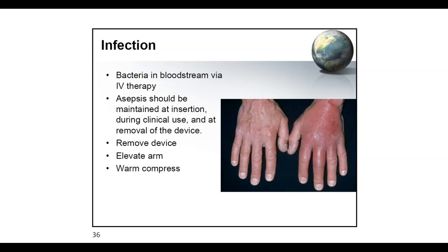And so it is very important to maintain asepsis when we're maintaining the IV, when we're inserting it. And really that's why also we want to assess the area. If the dressing looks soiled, then we need to change it. We also need to make sure that we're following policy and protocol and still maintaining asepsis and keeping everything clean when we are manipulating that device.